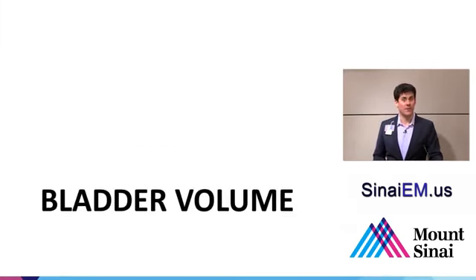So again, hydro is the main thing we're looking for, but again, you can see a bit of evidence of stones. So I mentioned bladder volume before. Let's talk about that in a bit more detail.